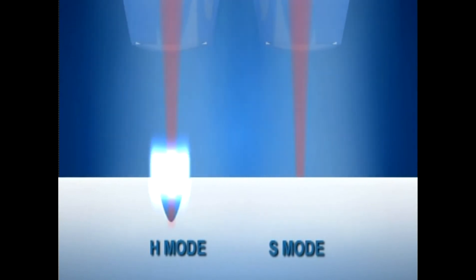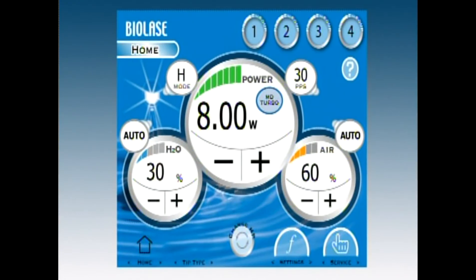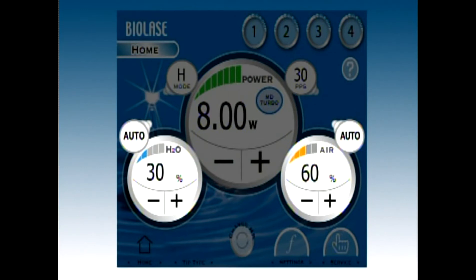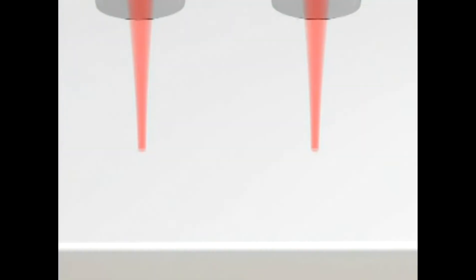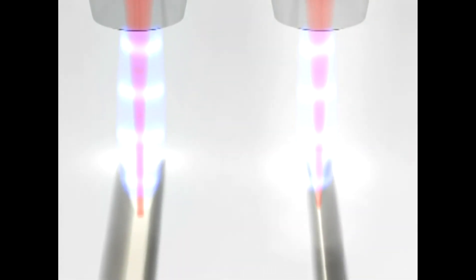H mode is used for all hard tissue cutting; S mode will not cut hard tissue. Hard tissue requires significant amounts of water spray in comparison to soft tissue procedures. 30% water and 60% air is a good starting point for air water spray settings. Water level below 25% or no water will produce charring. A good ratio is one part water to two parts air — simply watch your results and adjust as needed.